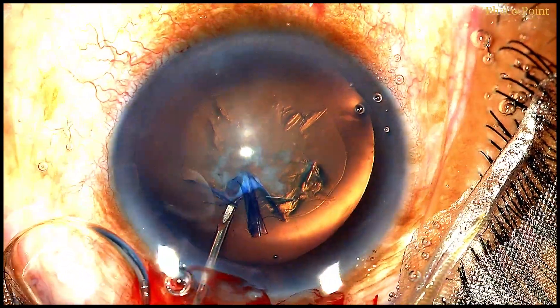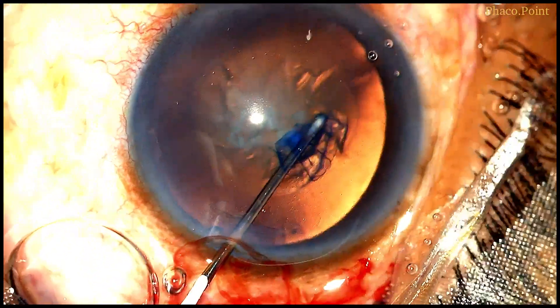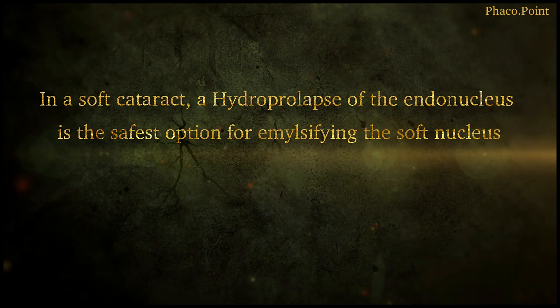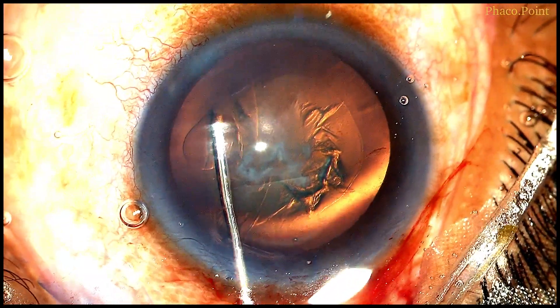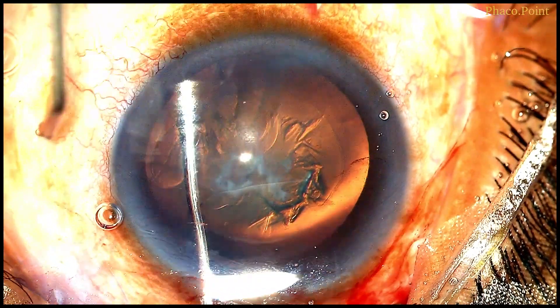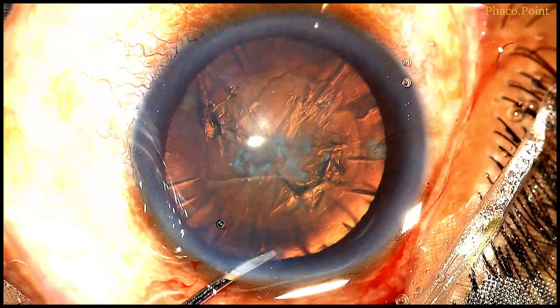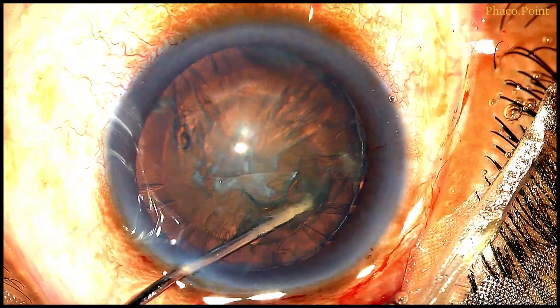My preferred technique of choice for nucleus disassembly, downsizing, and emulsification is always a hydro prolapse — wherein you delineate the endonucleus and hydro prolapse it out of the bag. This is perhaps the safest way of performing phacoemulsification in soft cataracts. First I perform a hydro dissection, which allows ease of cortex removal later.